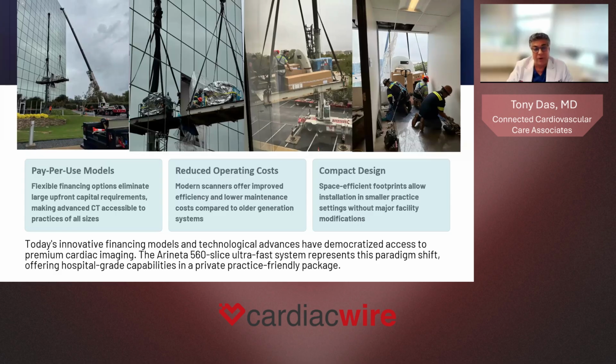We're not on the first floor. You can see we're on the third floor. A crane was brought in, 4 windows were taken out, and the scanner was brought in through the window. And the size of the scanner and the footprint allowed us to put this into a room that's roughly 16 by 14, and we can do scans right inside our office.